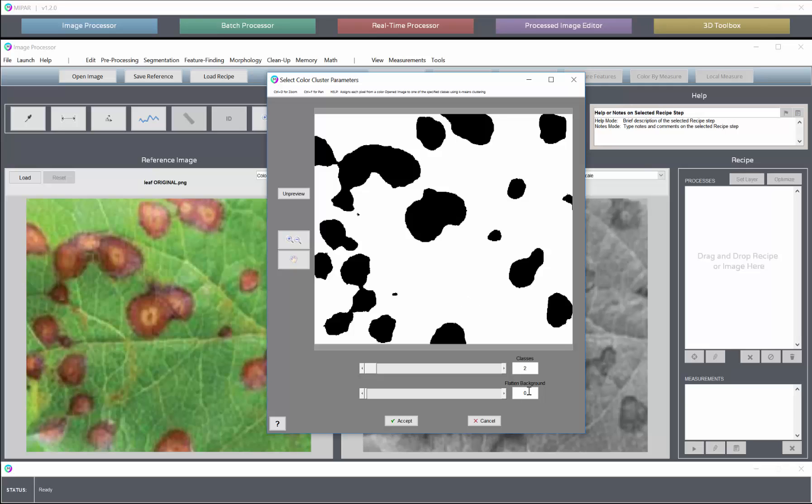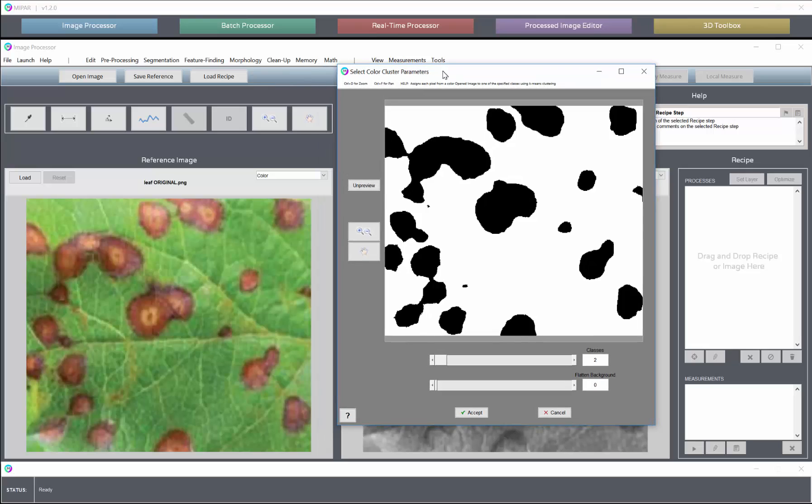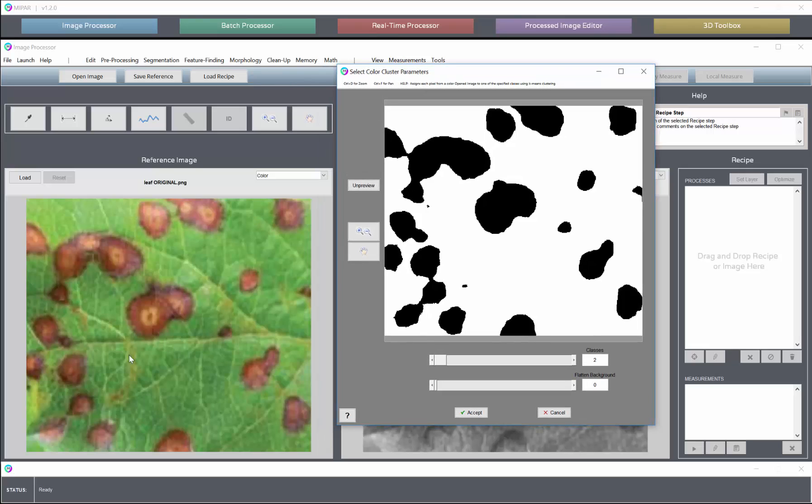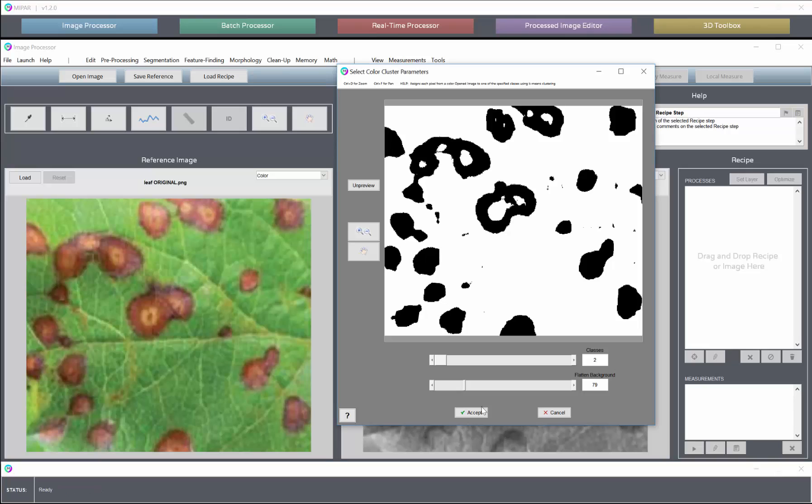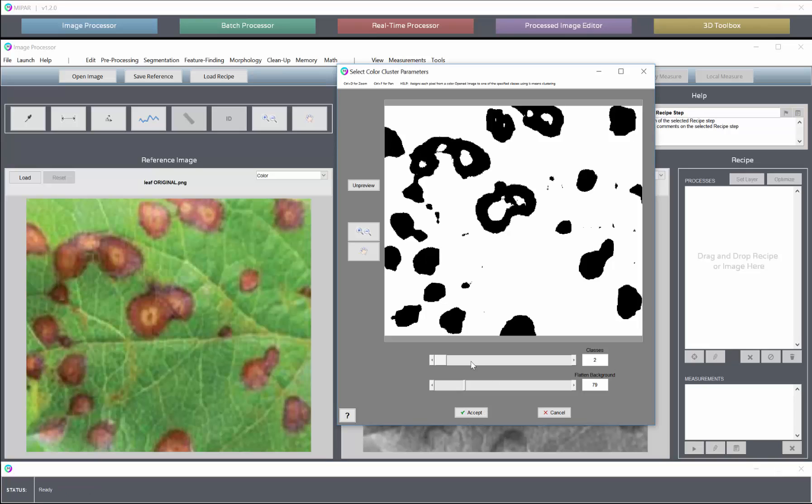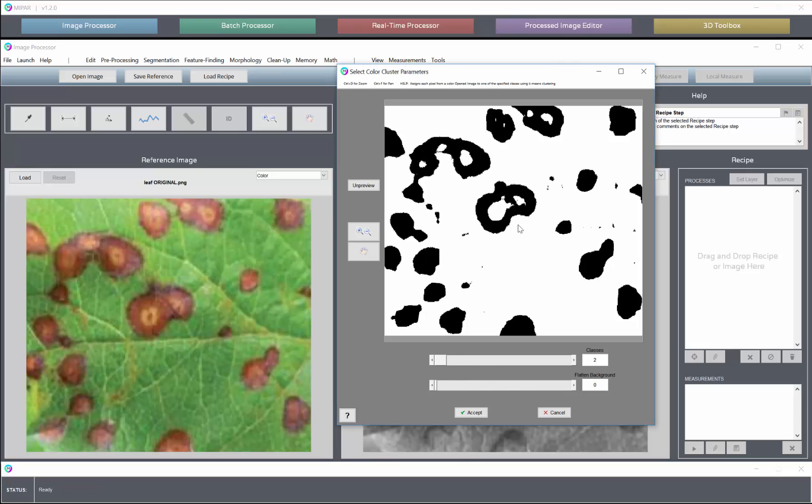The flattened background can be used in the case of gradients in the color image where you need to correct those before dividing. In this case I believe that no background correction is really necessary, so we'll keep that at zero.